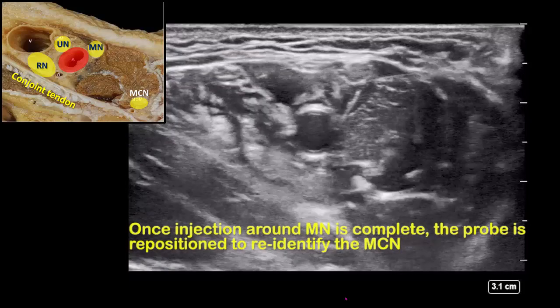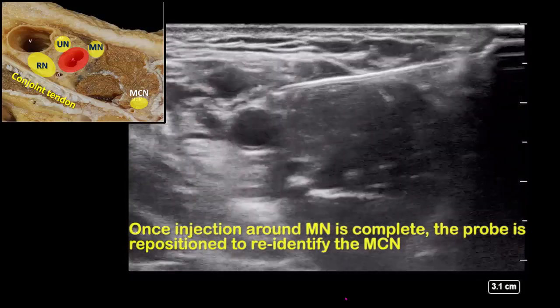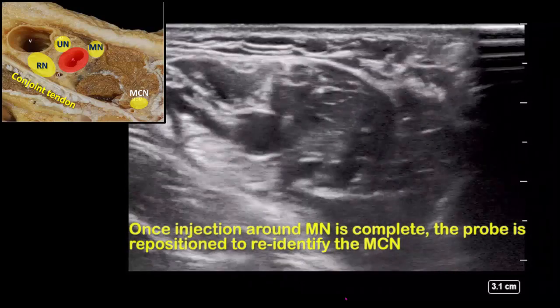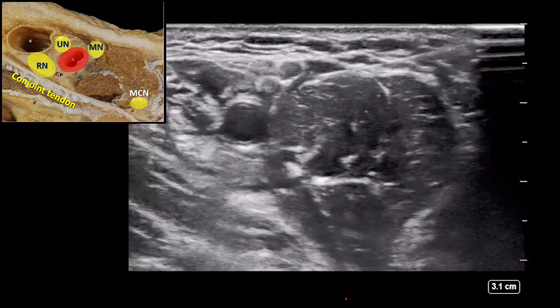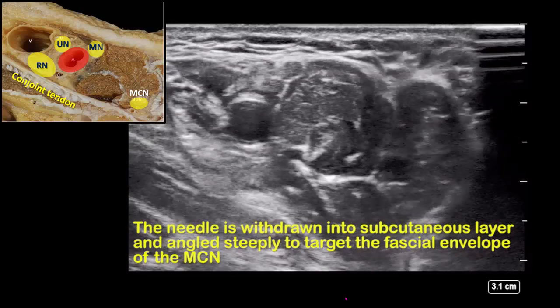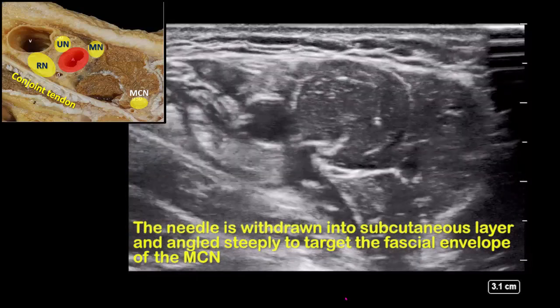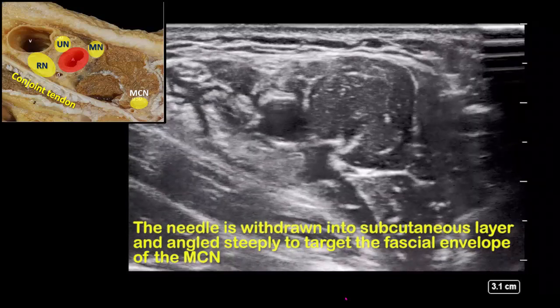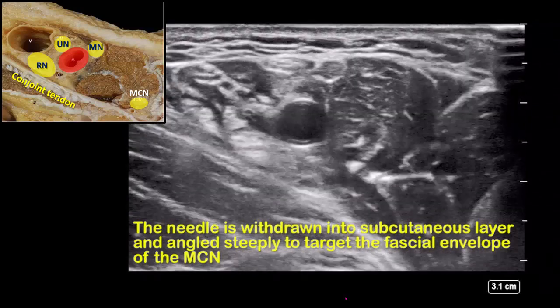With the median nerve injection complete, manipulate the probe to clearly visualize and identify the musculocutaneous nerve. Withdraw the needle into the subcutaneous tissue and insert at an appropriately steep angle to pierce the fascial envelope, taking care to avoid the nerve itself. Use a separate skin puncture site if necessary, and track the needle tip by its motion through the muscle.